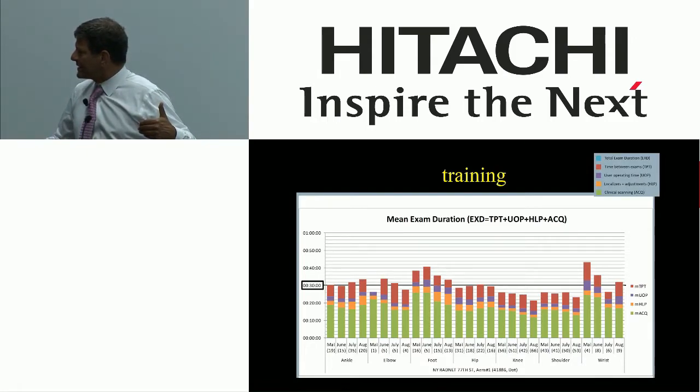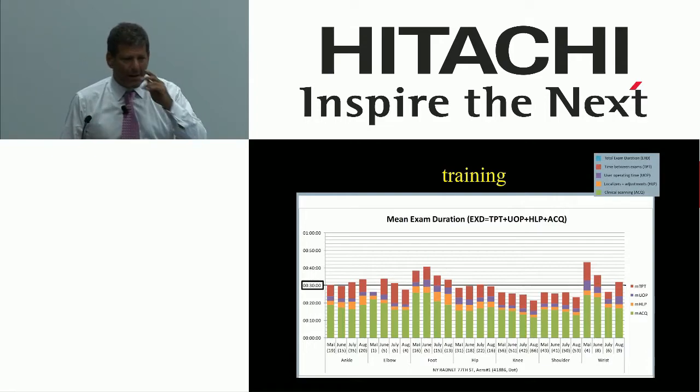We noticed the foot was a little high, ankle was a little higher than we'd like. The elbow, we probably don't do enough of those, so that sample's too small. Even the wrist is a little small. But for the most part, we noticed that foot and ankle were problematic.